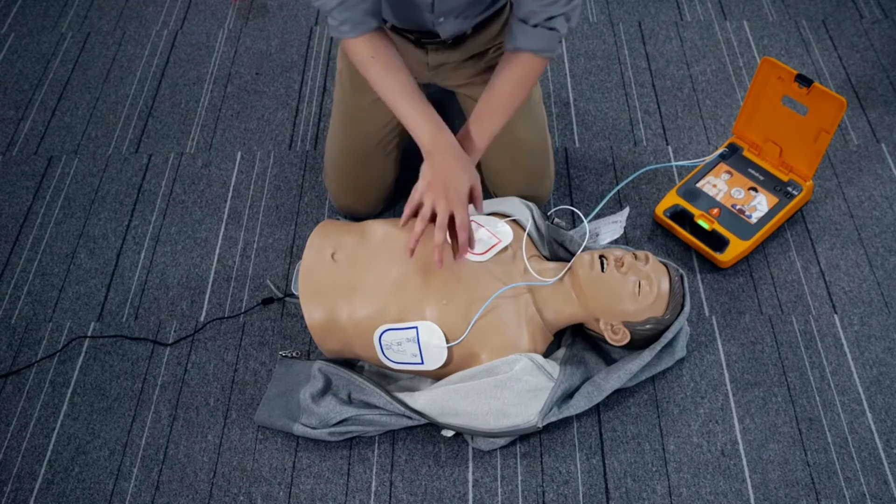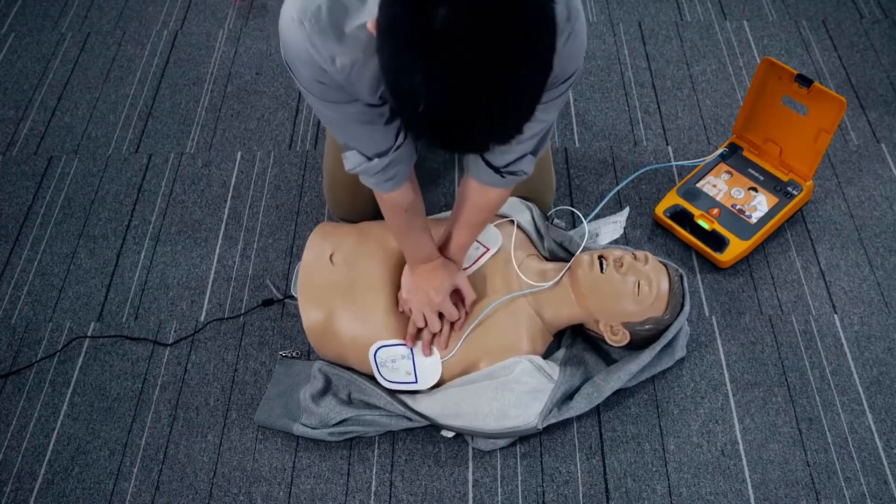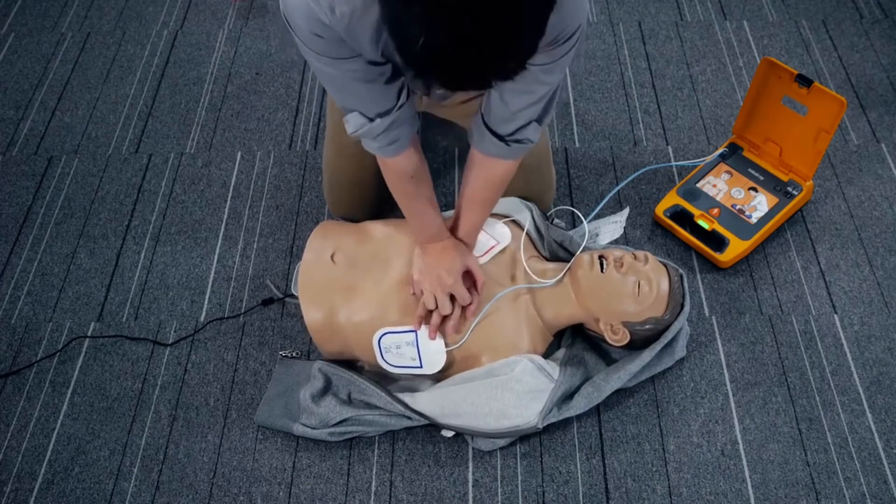Start CPR immediately. Follow the metronome to give 30 compressions and 2 rescue breaths.